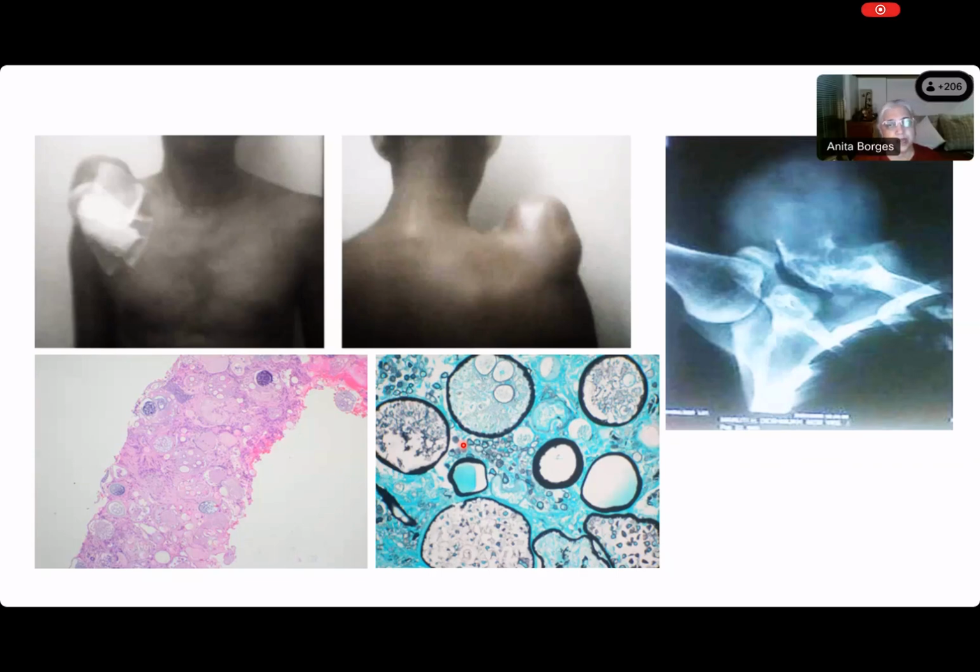Now, Sarangi, you want to help Prayas and say what you are actually seeing? What are you seeing? What are all these very big things? You think that this has been photographed under an electron microscope? Yeah, it's huge, isn't it? Yes, ma'am. So what are these things then? That have these very large, and inside you have smaller structures. Yes, some kind of parasite.